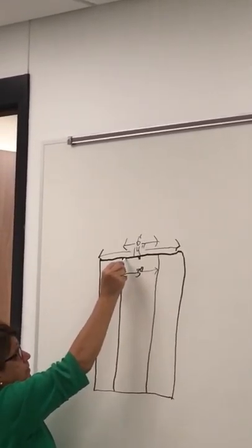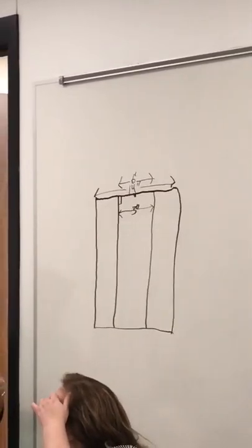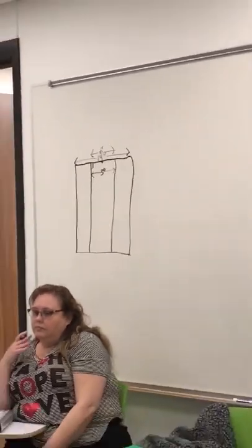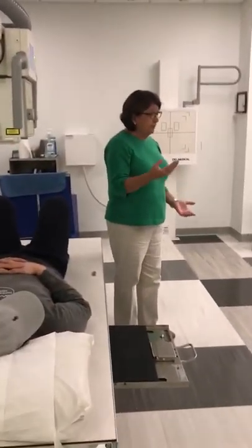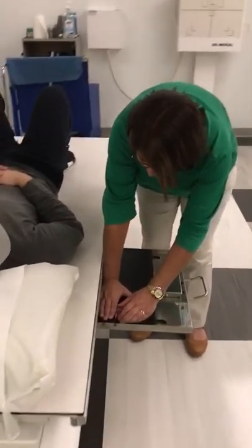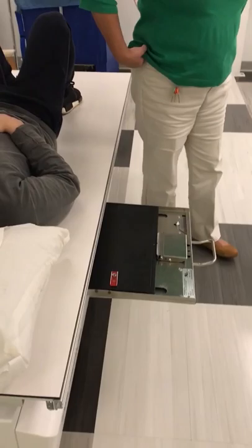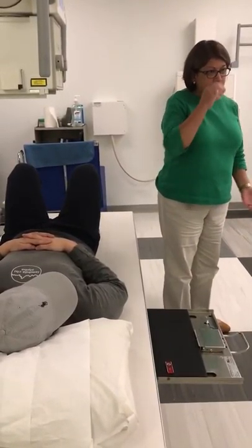So if you place your marker 3 inches away from the center of the IR, your marker will still be in the collimation field. And you know what 3 inches is, because you've all figured out with your fingers what your 3 inches is. So, I'm going to put my marker right there. And your marker is placed superiorly within the collimation field.